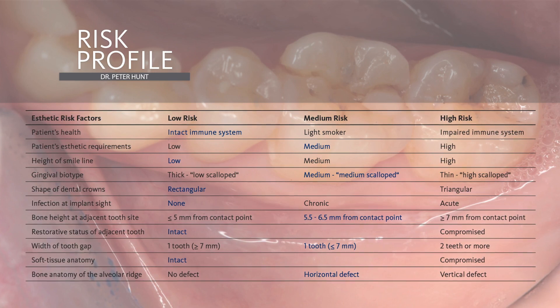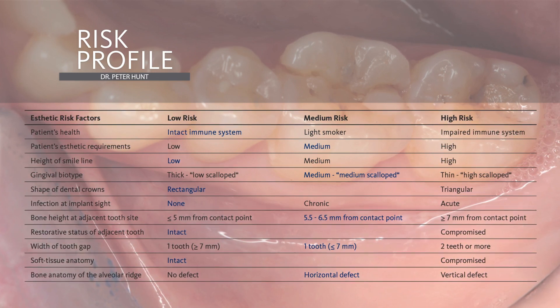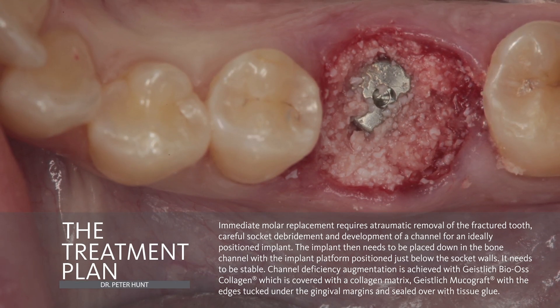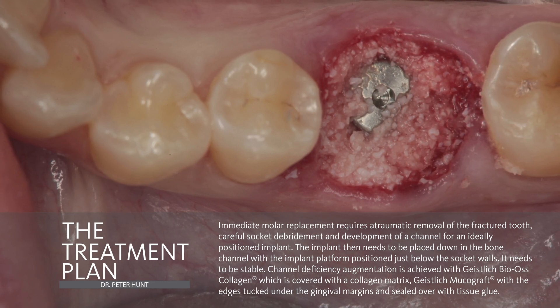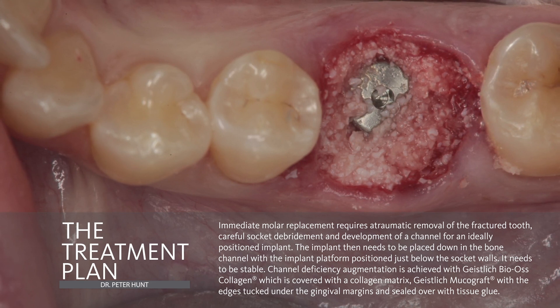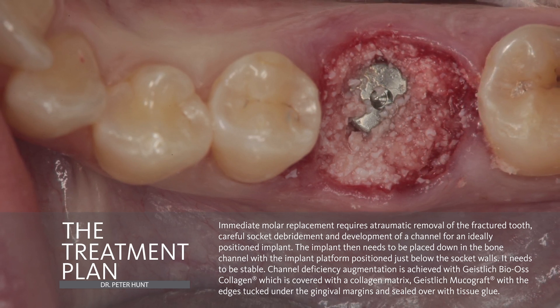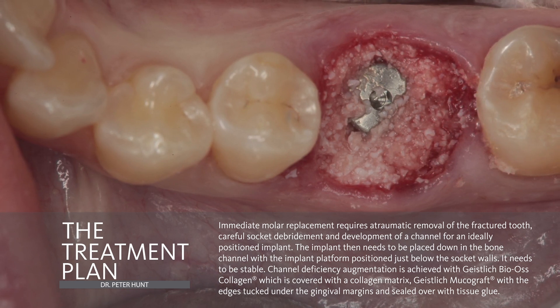All of the anatomy is in good condition, apart, of course, from the particular tooth. This is a straightforward procedure. Patients often have to spend a great deal of time in therapy for the replacement of a mandibular molar or a maxillary molar. Essentially, this process is taking a socket regeneration and blending that with an implant placement. And by doing this in combination, we can have very high success rates and we can speed up the therapy and have one major procedure.